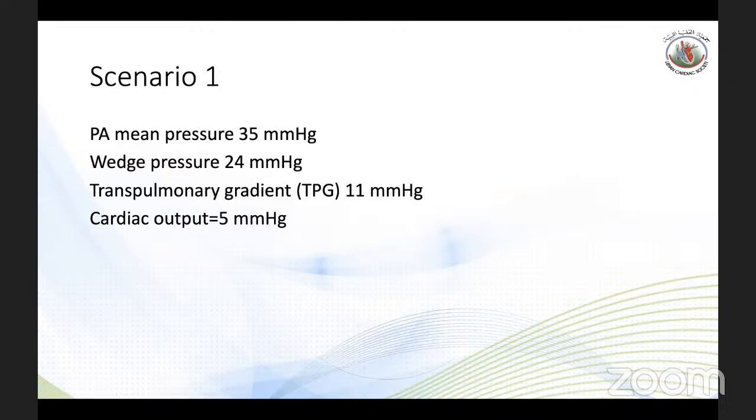We do right heart cath, and it's a Swan in pretty much 90% of our patients. Unfortunately, we're still lagging in terms of monitoring patients. Our center still does Swan, and 90% of the patients go for open heart surgery. My 2 words of caution when you do right heart cath, and somebody comes with a very slow heart rate or left bundle branch block: I've had 3 or 4 patients who had asystole. As soon as they pass the catheter down, they try to float the catheter, and the patient arrested. So this is a word of caution.